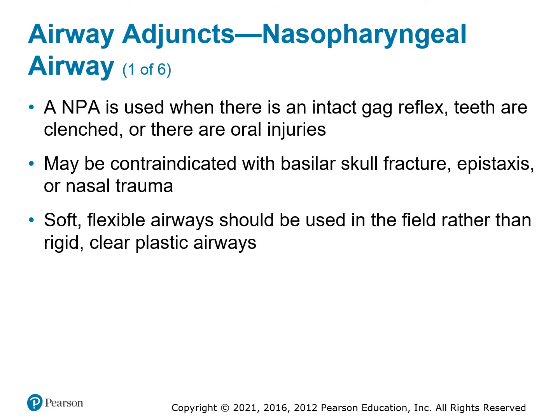The NPA is used when there is a gag reflex, so they might throw up, you're unable to open the airway, or there's some sort of facial or oral injuries. You cannot use it with nasal injuries, especially if there's nose trauma or a basilar skull fracture, because you don't want to put that NPA into their brain. We want that to go into the pharynx.